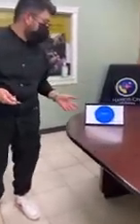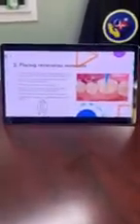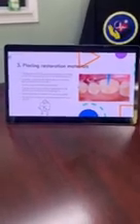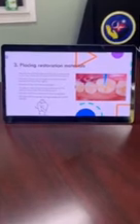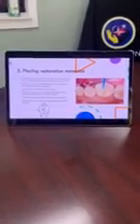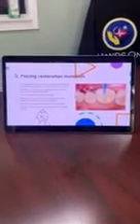So the next step is placing the restoration materials. First, we should transfer the etching agent to the dentist and be ready with the saliva ejector when he rinses the etching agent. Next, we should transfer a microbrush applicator to the dentist, along with the primer agent.